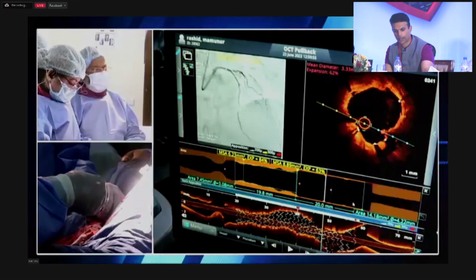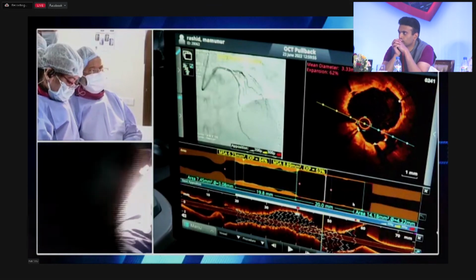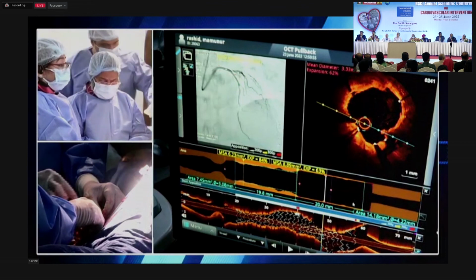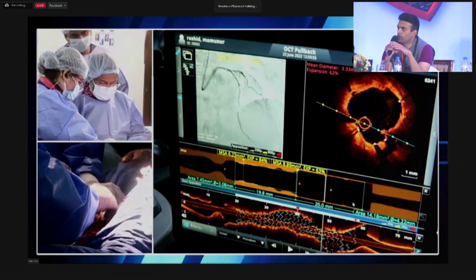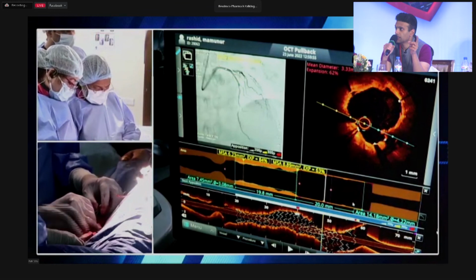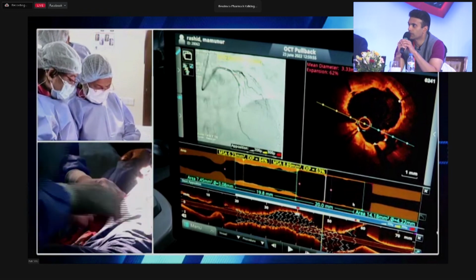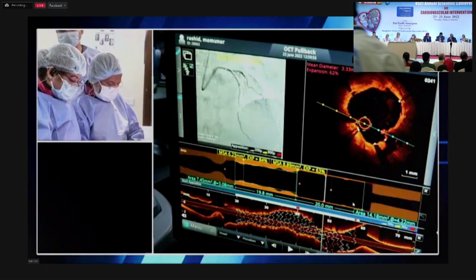I have post dilated with the 5.0x8 at 16 atmospheres. May I show once again by OCT what is the situation of that prolapsed plaque or tissue? If you've post-dilated with a 5 or with a 4.5, whatever, crossing over that segment, then if you're convinced of what you've done, I think you're sort of obligated to re-image it to make sure that you fix the problem. That's right. I am going for re-imaging.